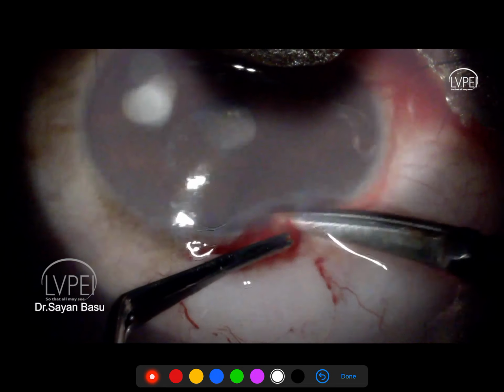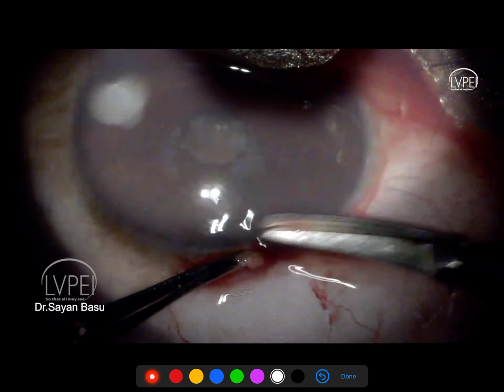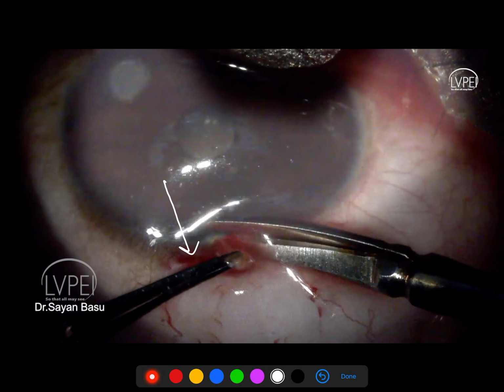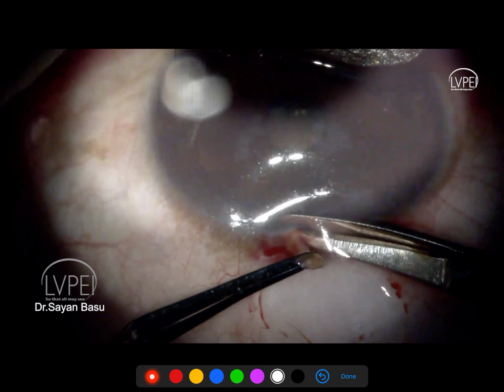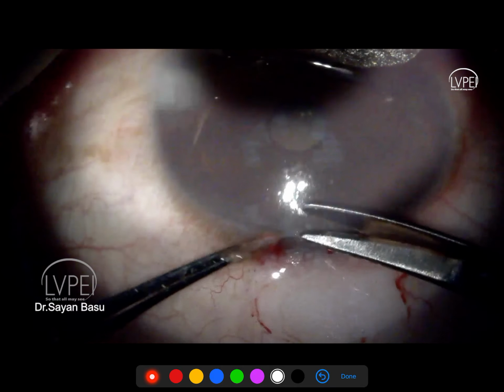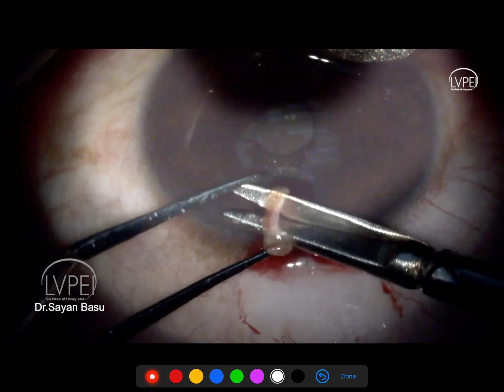And then when you are taking this graft, remember that when you insinuate your blade, it goes all the way into the dissected flap. So don't undercut, okay? Otherwise you would have dissected limbus nicely, but when you're cutting it off, you may not. And also notice here that I am using a non-toothed forceps to hold the limbus and not a toothed forceps, because I do not want to cause any trauma to the very delicate stem cells that are in that area. And I'm continuing my dissection throughout the ledge that I have created, and this is the tissue that I am going to transplant.